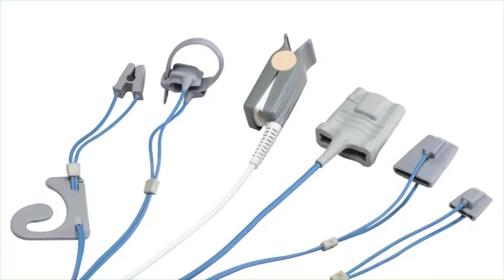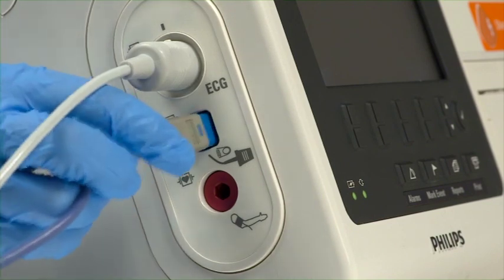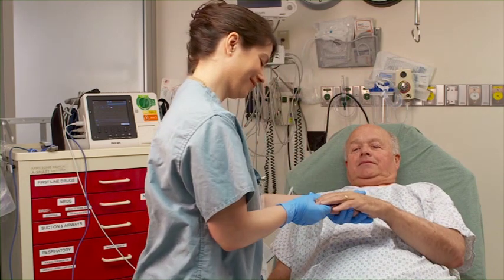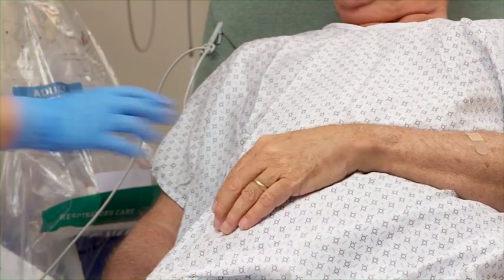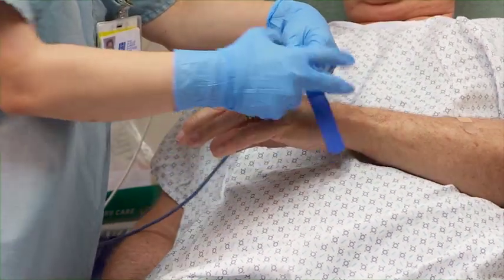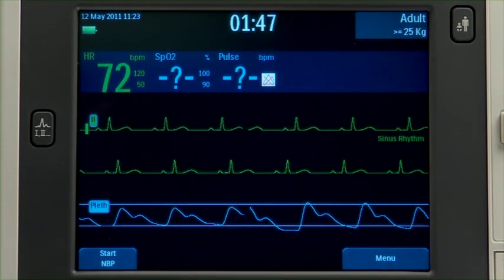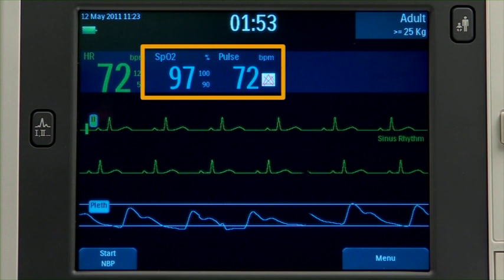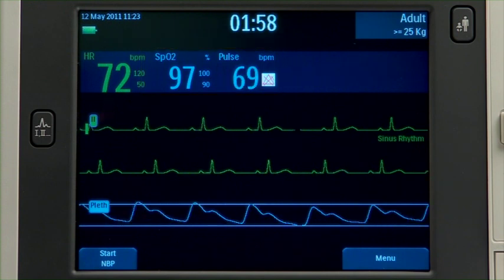Now let's set up SPO2 monitoring, which is also available in AED mode if configured. Insert the blue connector into the port located on the side of the XL Plus. When choosing a location for the SPO2 sensor, the most important consideration is to pick a site that is warm and has good perfusion. Apply the appropriate sensor to the patient. A PLETH wave displays while the oxygen saturation is measured and the value is calculated. Within seconds, an oxygen saturation reading and patient pulse rate appear, and the SPO2 value is updated continuously as the patient's oxygen saturation changes.